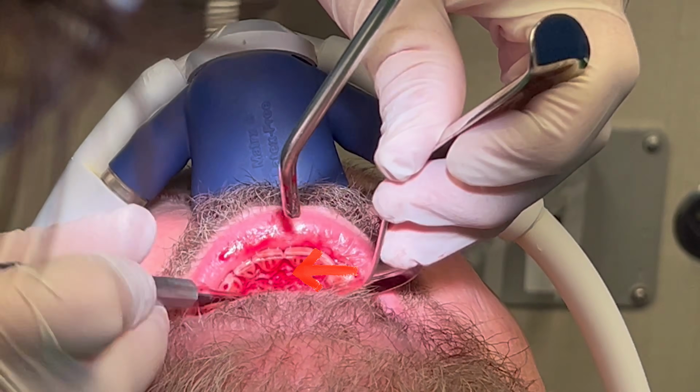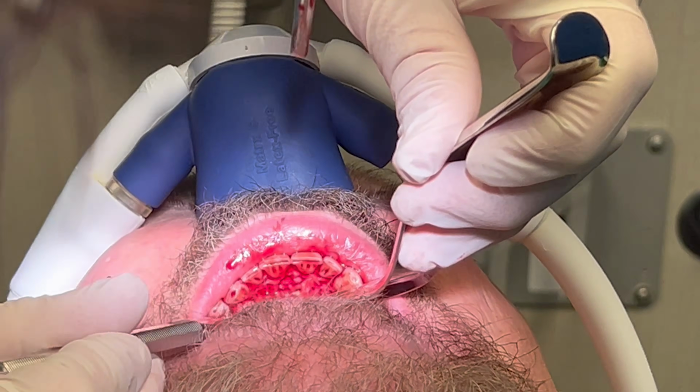Here is the lesion coming into view and some of the contents within this lesion as well.